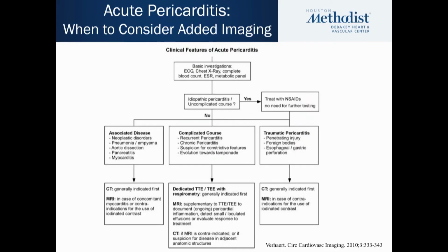So, not everybody needs CMR, CT imaging when it comes to acute pericarditis. There are tables out there that can help you, but do consider these advanced techniques whenever you have a patient who has a complicated course, recurrent symptoms, suspicion for constrictive features.